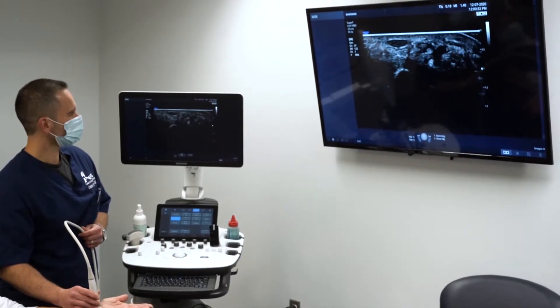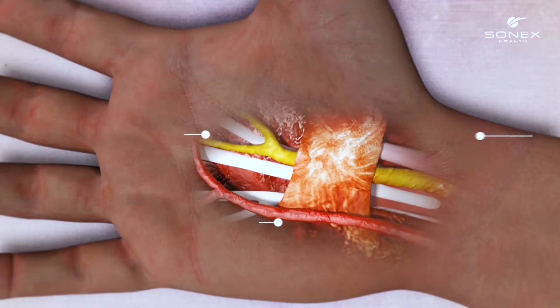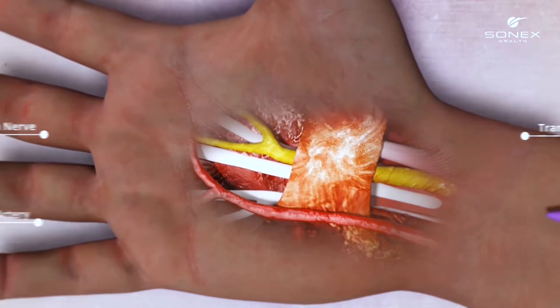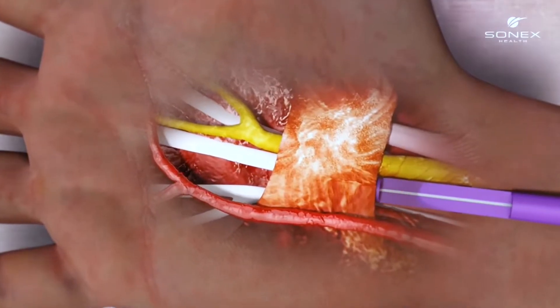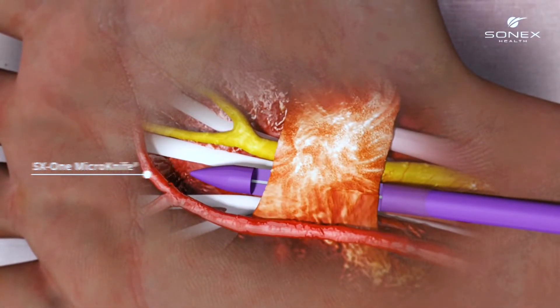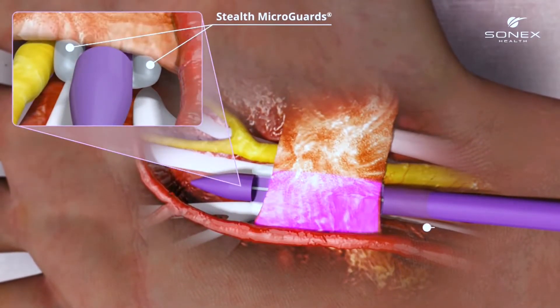We find our anatomy using the ultrasound and then insert the Sonex device. When we know we're in the right spot, the Sonex has a lot of safety features built in — it deploys balloons that separate the nerve and the artery, making them farther apart so that we have more room to work.